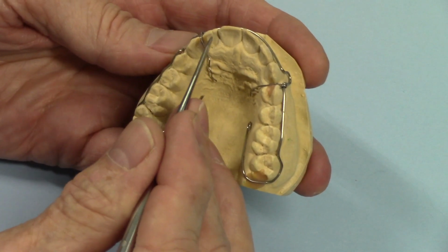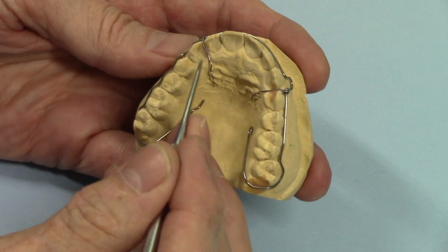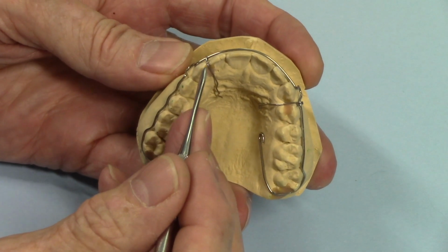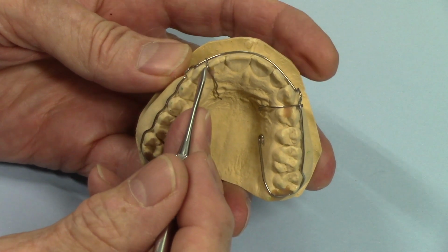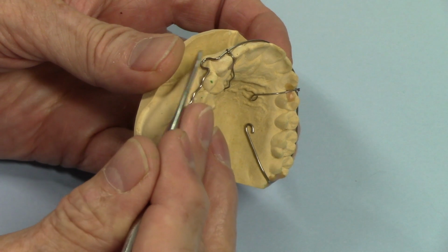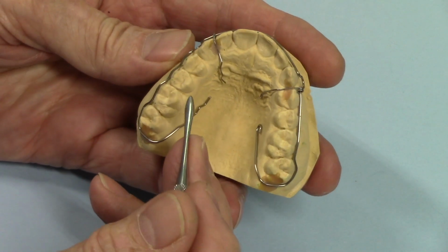Usually you just try to find a space in the occlusion that's free to allow these wires to go through. The trouble with these is that they're usually thin so that they don't interfere with the occlusion, and they often break. And if they break, then you've got that real floppy action of this wire.